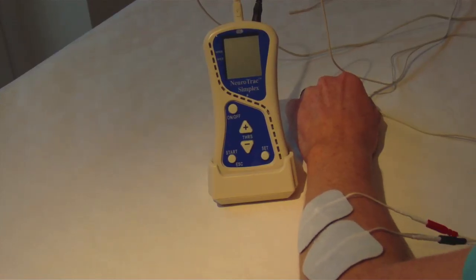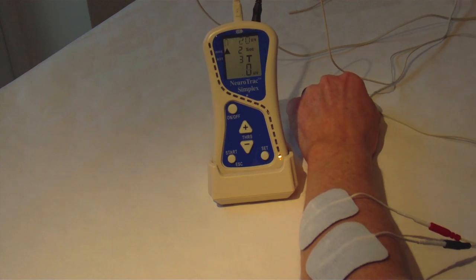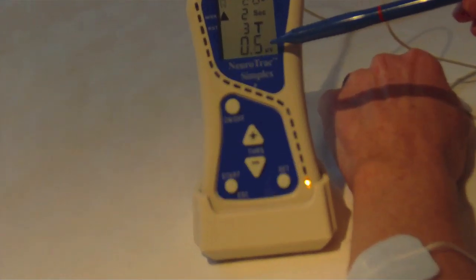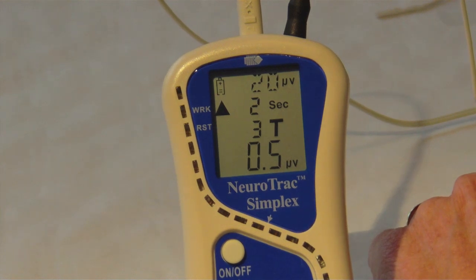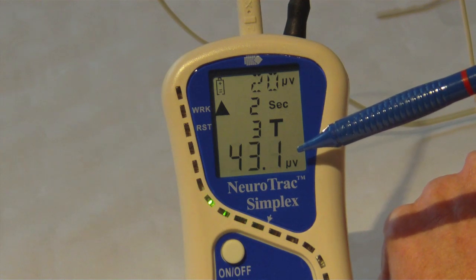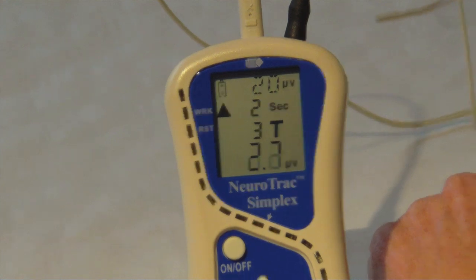I'm going to demonstrate biofeedback using my forearm muscles. Firstly press the on/off button once and let's have a look at what you see on the display screen. This number at the bottom of the screen is measuring activity in my arm muscle — if you are using the vaginal periform, the number is a reflection of your pelvic floor muscle activity. If I completely relax my arm muscle the reading drops; if I contract it the reading increases. In lying, you would aim to relax your pelvic floor muscles to get this reading as low as possible.